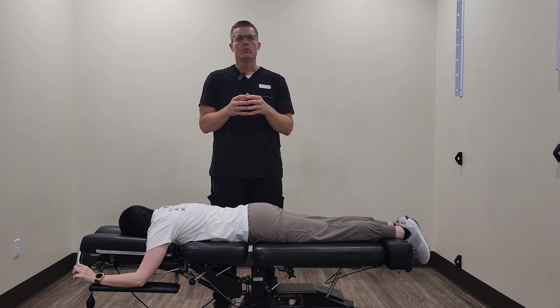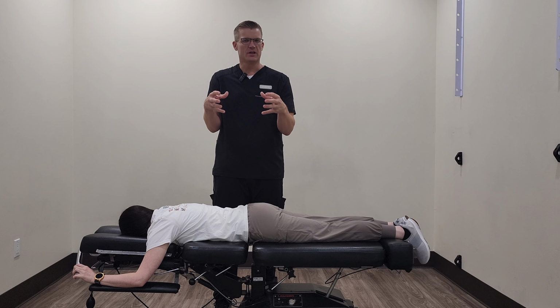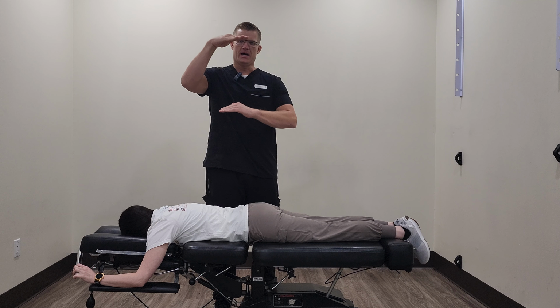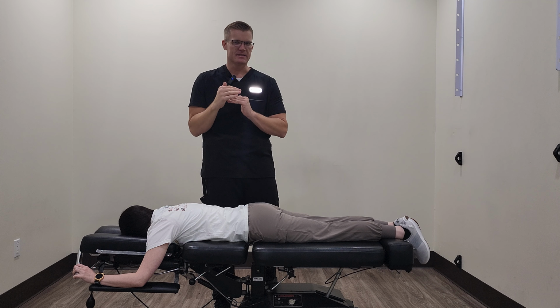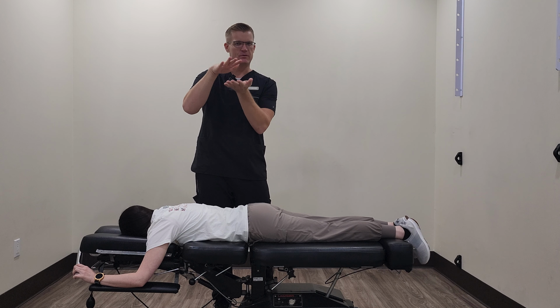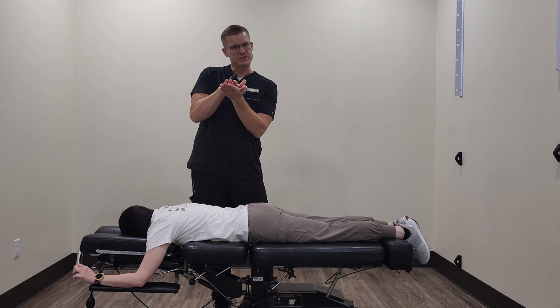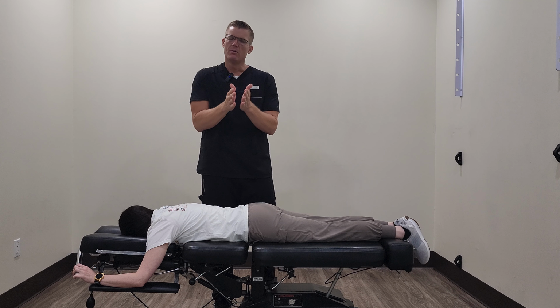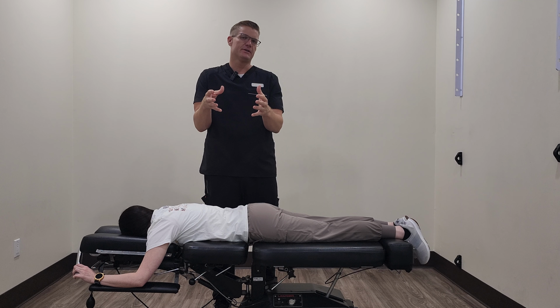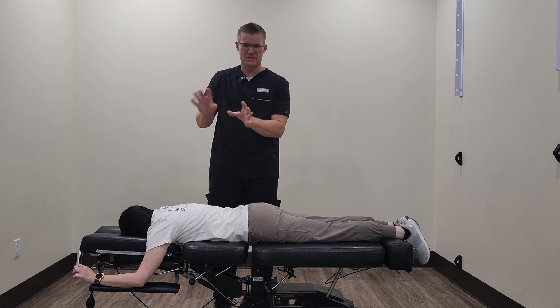It's a great technique. What it's going to do is pull and distract the areas of the lumbar spine that we're trying to work on. If you think about a peanut butter sandwich, we're going to use a basic analogy here. We have two pieces of bread with some peanut butter and jelly. What's happened for a lot of us is that peanut butter and jelly, which would be analogous to the disc, has been squished out and pushed to the sides. What we're trying to do is move those two pieces of bread apart to help keep that material where it's supposed to be.